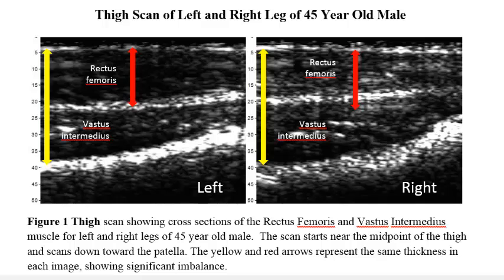The yellow arrows, which are the same length, show that the total muscle thicknesses are comparable for both legs. However, the thickness of the individual muscles are very different for the two regions. The rectus femoris muscle on the left leg, depicted by the red arrow, is significantly thicker than the right leg.